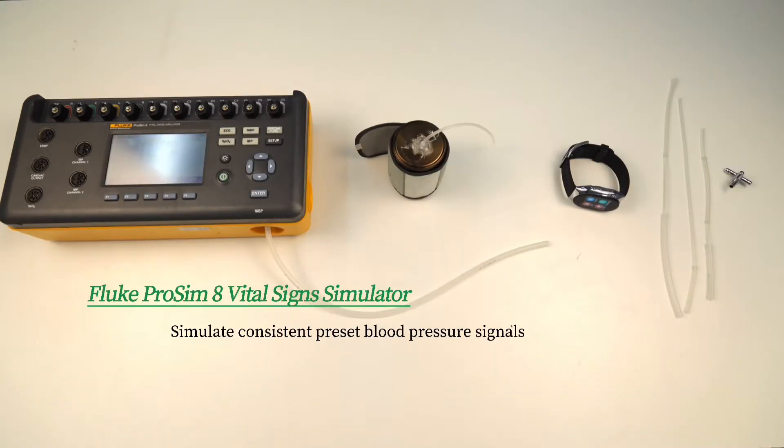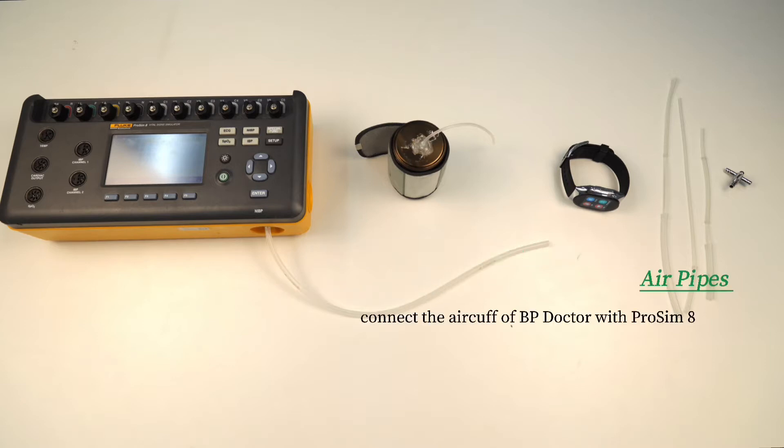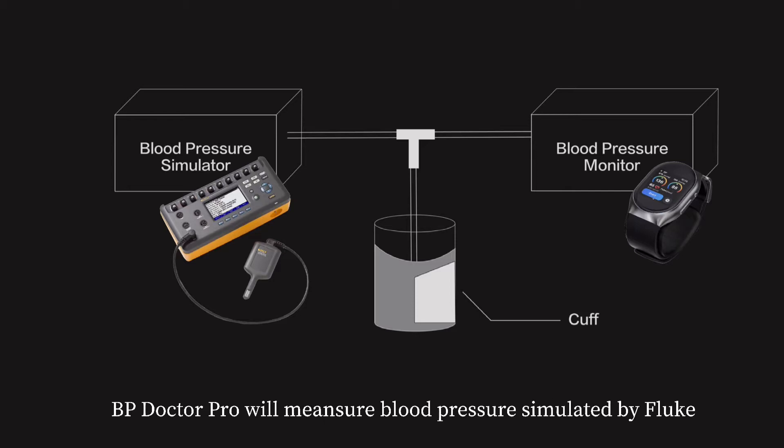The equipment used includes the Fluke ProSim 8 Vital Signs Simulator, a metal container, the YH-BP Doctor Pro smartwatch, and air pipes. In this experiment, Fluke ProSim 8 acts like our arm — an arm whose blood pressure we can set. BP Doctor Pro will then measure the blood pressure simulated by Fluke.